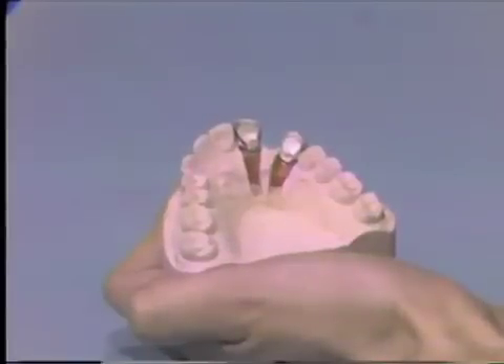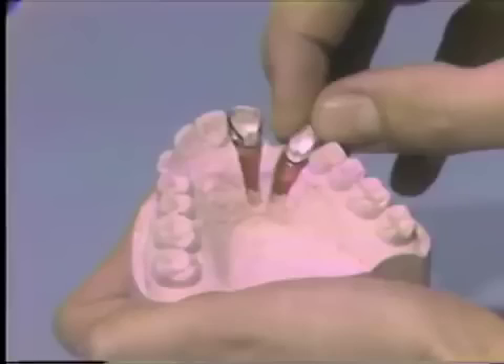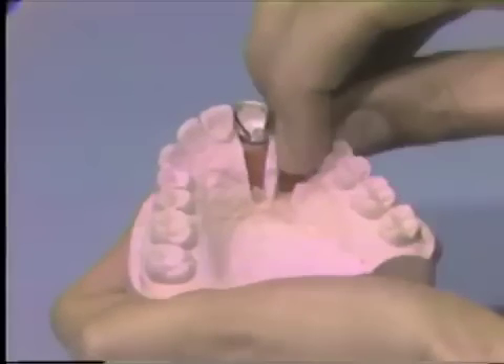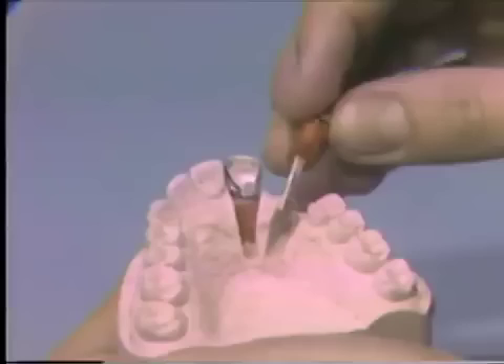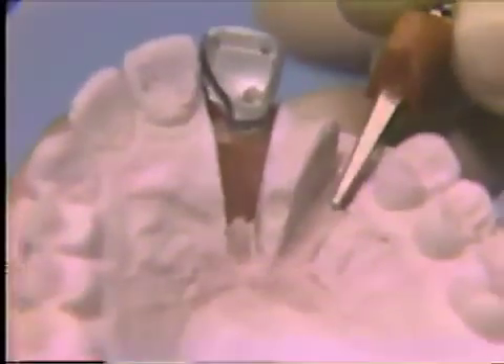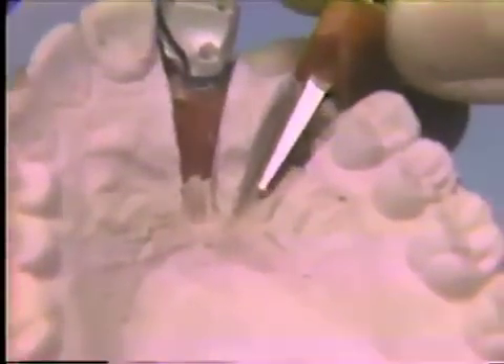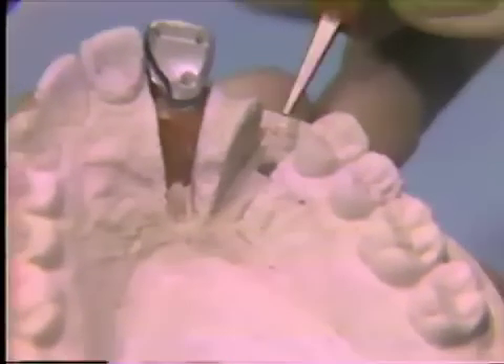The dies are now ready for waxing. They are stable and easily withdrawn. One can see the anti-rotation lock on the base of this die, as well as the anti-rotation groove in the base of the model, which will give a very stable die.